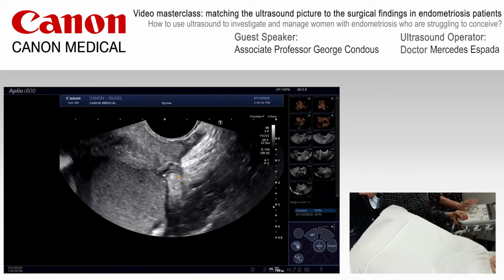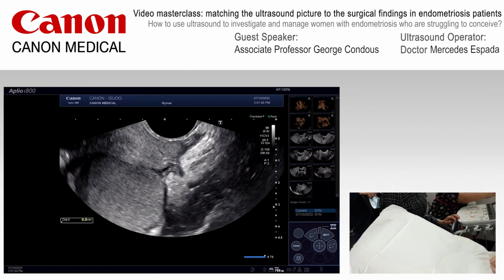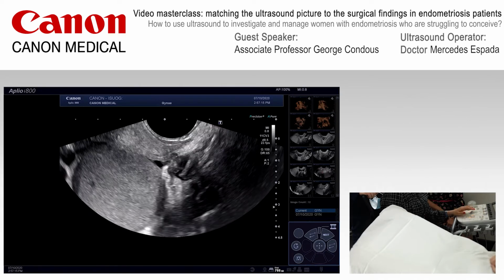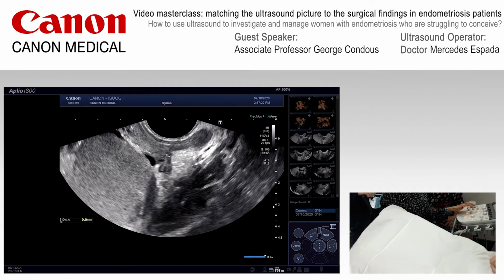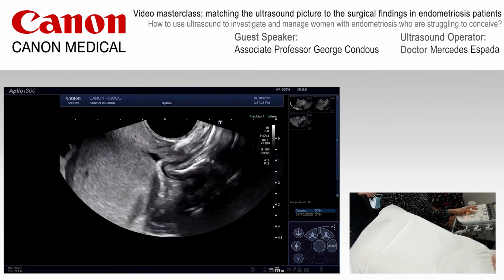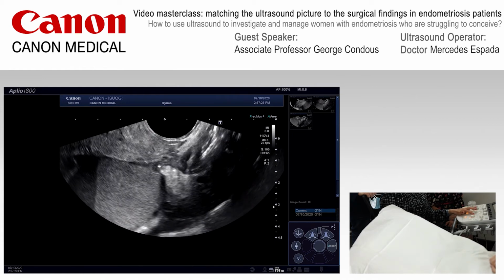And you can see that just behind the cervix, we bring up the arrow to the right on screen of the actual endometrioma, we can see that there is a hypoechoic lesion just there, and that's probably, we'll measure that and probably come into view, but that may well be within the vicinity of the torus uterinus. So where the two uterosacral ligaments converge in the midline, this is the origins of the uterosacral ligaments. This is the torus uterinus. So we've got a torus uterinus lesion itself.